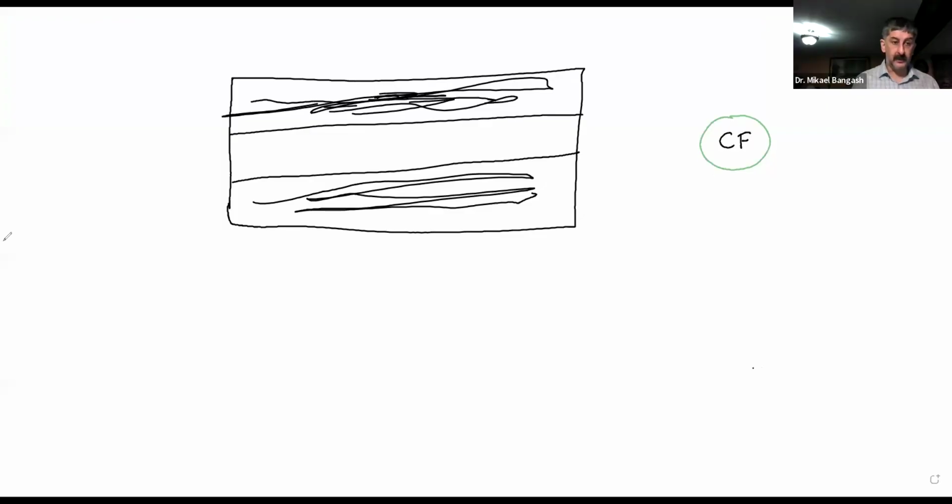Now, what you may see in this instance here is your box. What we had before is that the blood vessel itself was showing up as a little lighter gray color. Clear.